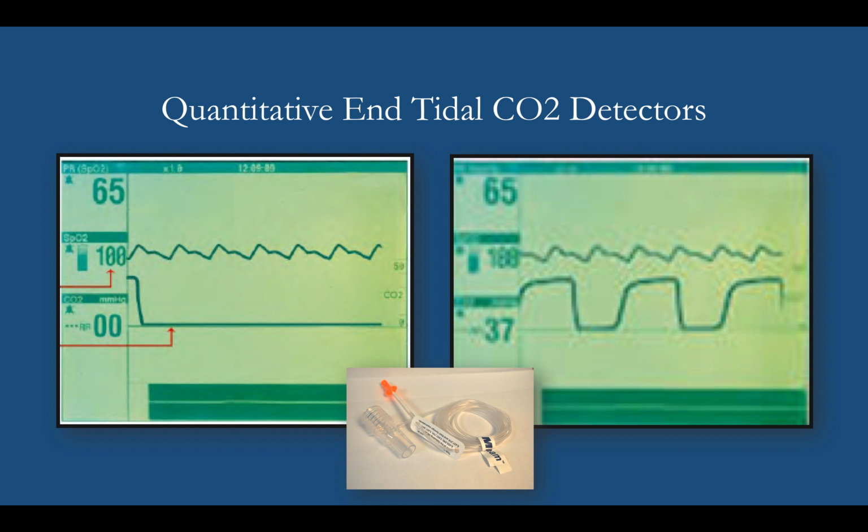This is a quantitative end-tidal CO2. Looking at the lines, you'll see on the right-hand side there is inspiration and exhalation, indicating that you are in the lungs. The left indicates no detectable carbon dioxide, which likely would mean you are in the esophagus.